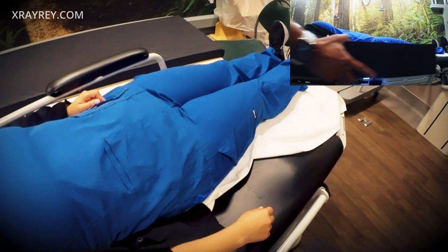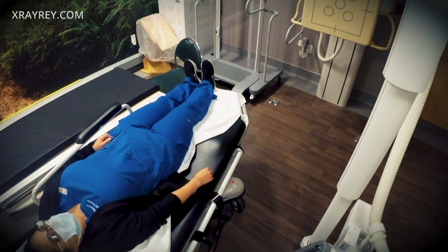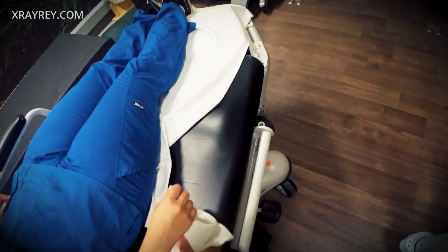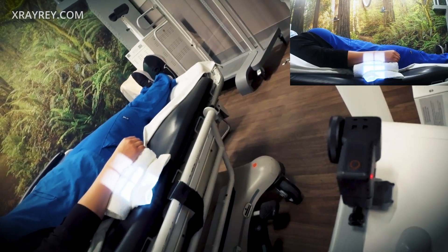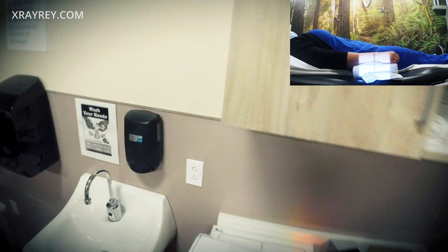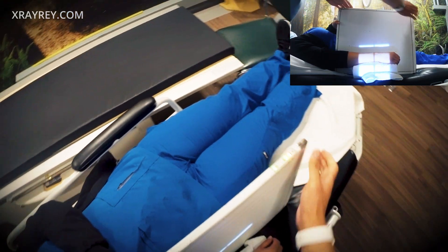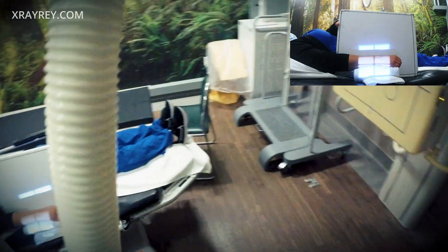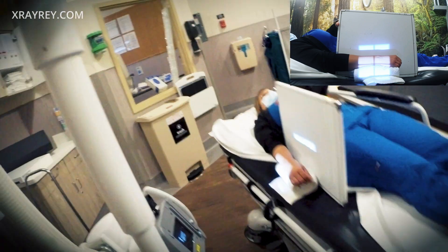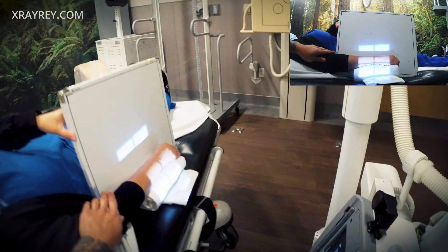I'm going to lift up your arm here and put this under. All right. And I'm going to bring this up here — there you go. Are you able to hold this here with your left arm? Just turn your arm just a little bit more to your left if you can — kind of, there you go. Okay, hold very still.